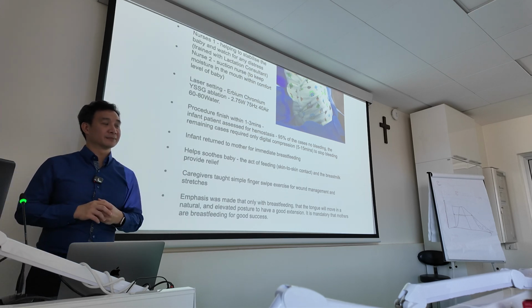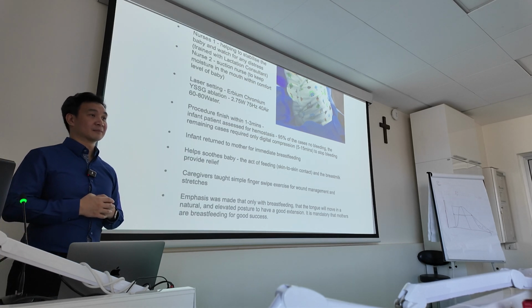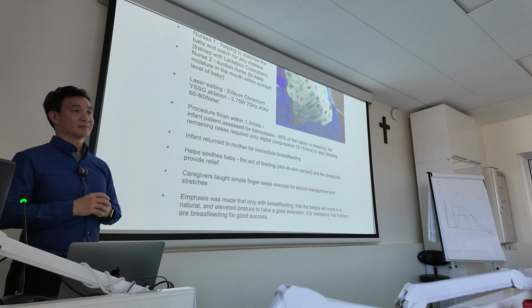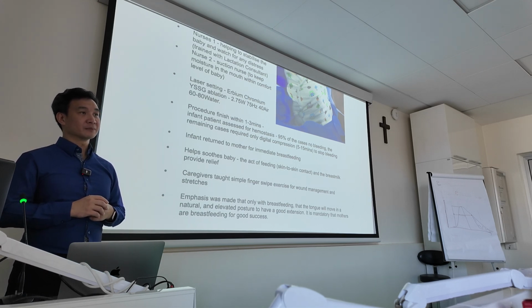Phil Ham did the first module lecture. When he has no commitment with a brand or company, he prefers the diode and uses the diode, and he works very well, very accurately.